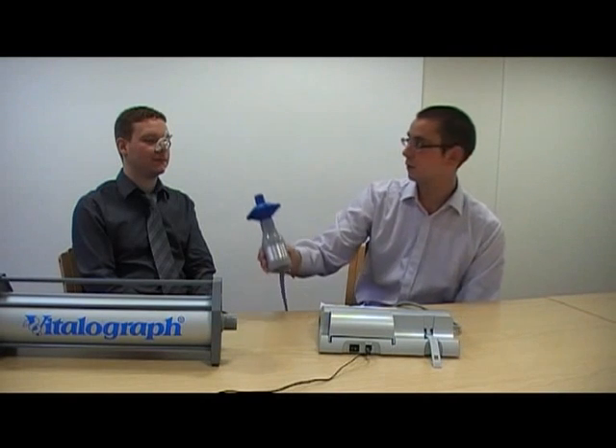Attach a bacterial viral filter to your spirometer flow head and hand this to your patient. You will need to instruct your patient as to exactly what they need to do.